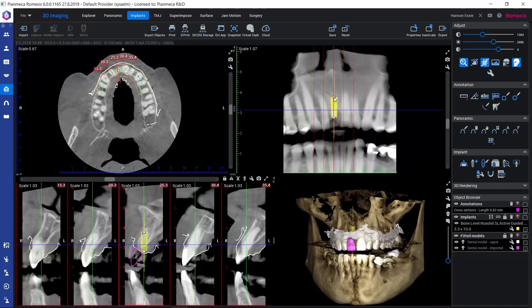Firstly, when we are adding an implant to the maxilla, we could simply flip it by right-clicking on top of that and selecting flip, so we get it initially in the right direction to start with.